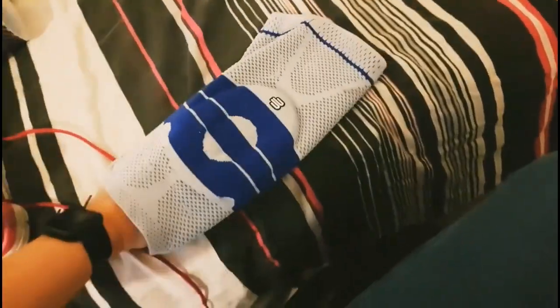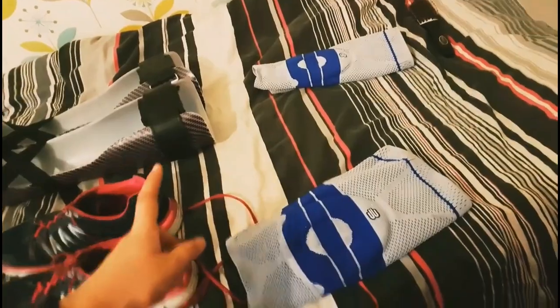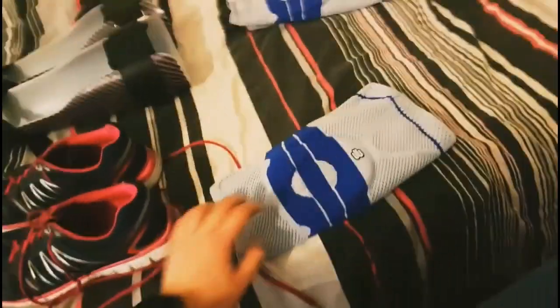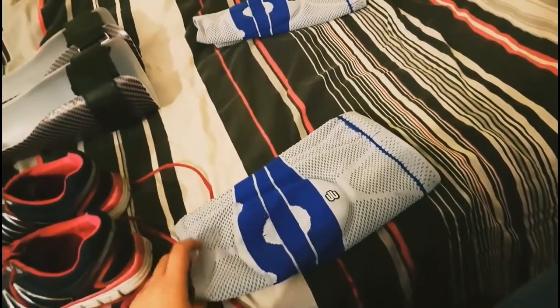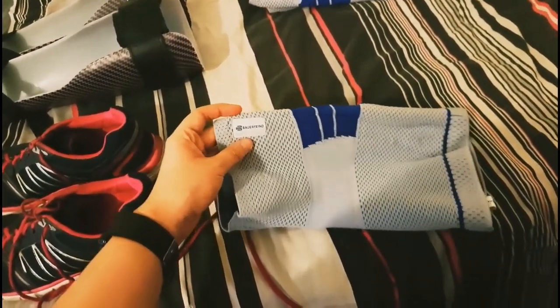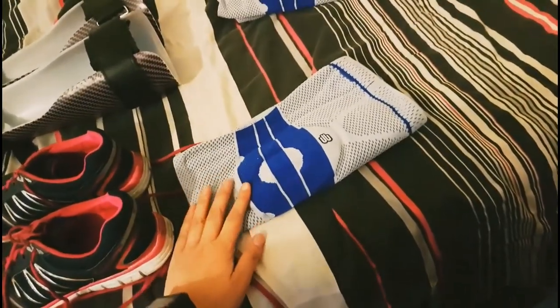Now, these are the knee brace part. They chose to give me separate knee braces and AFOs because they are lighter than the alternative, which is a KAFO, or knee, ankle, foot, orthotic. These are made by Bauerfeind, I think they're called. Yes, there's a name there. I'm sure I'm not pronouncing that correctly, but anyway. I think they're called Genutrain or something.